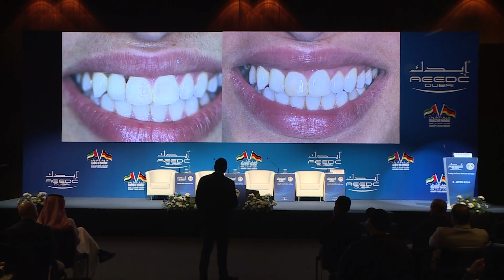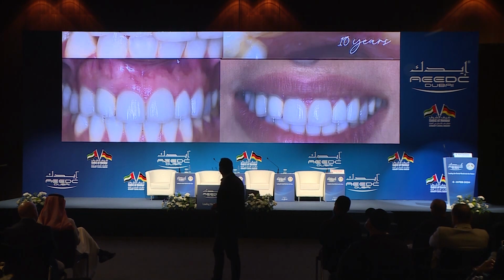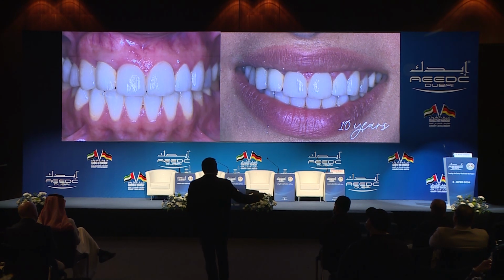This patient is still in Lebanon, and she's still working as a dental medical rep for an implant company, so I always see her. And I brought her back again 10 years after. This is the healing. After 10 years, she's still there. The tissue's still there. And then just last week, Giorgio brought her for another follow-up, a 12 years follow-up.